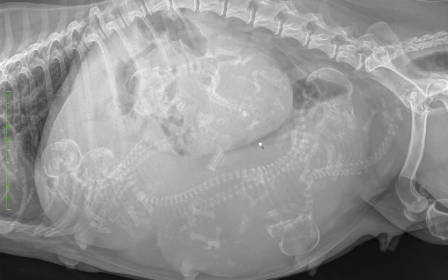Of course, you definitely want to reach to ultrasound as a tool for a better assessment of fetal distress, where you could monitor the fetal heart rate. But let's go back to our RADs to look at positioning.